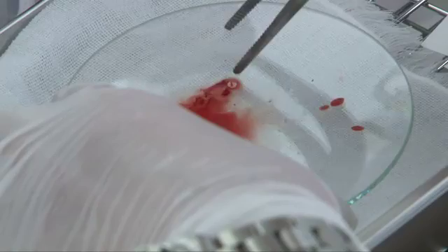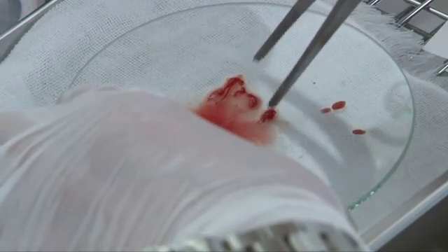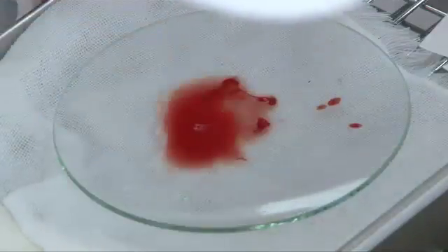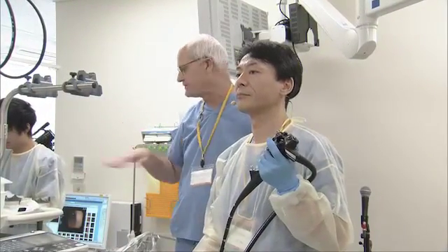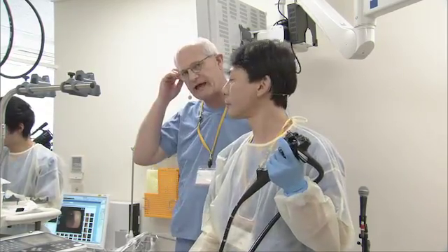So this is a difference in our practices. I use a stylet for the first pass, but we feel the balance of studies suggests the stylet is not helpful. So to increase efficiency, my own practice is to not use the stylet after the first one.